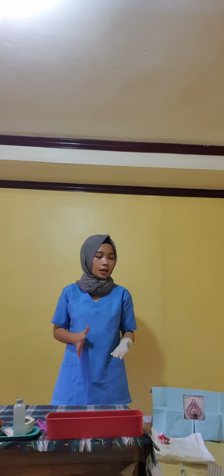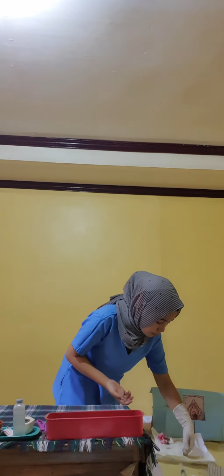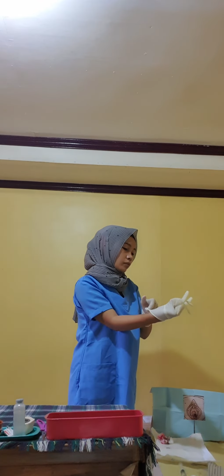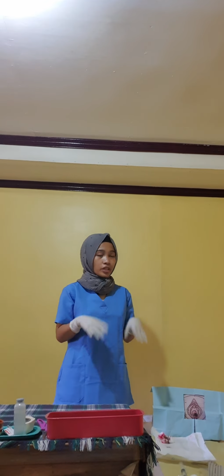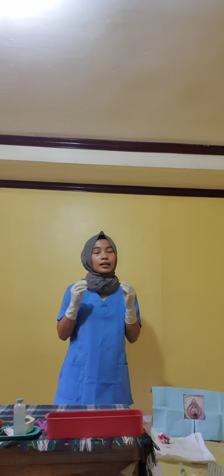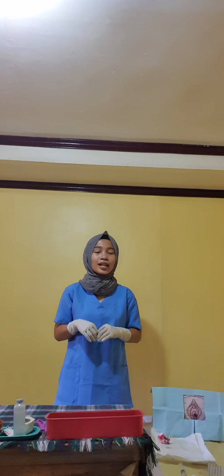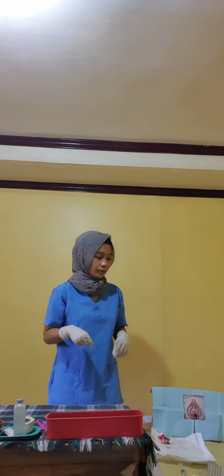So next, put on sterile gloves on the non-dominant hand. Rationale: to prevent contamination. So next, for an indwelling catheter, attach the syringe and test the balloon by instilling 10 cc sterile water and deflating the balloon by withdrawing the water. Rationale: to check for balloon patency and defects in the catheter.